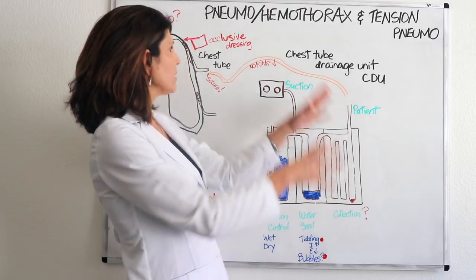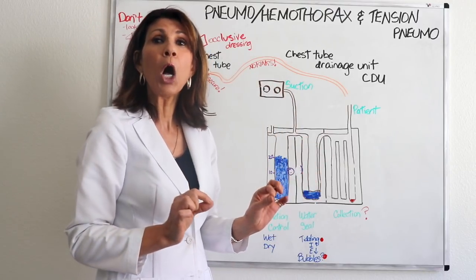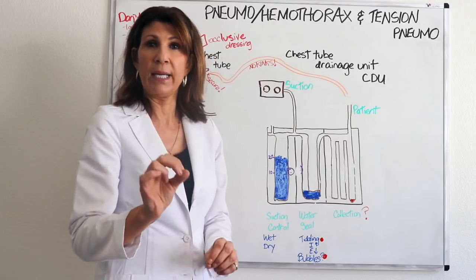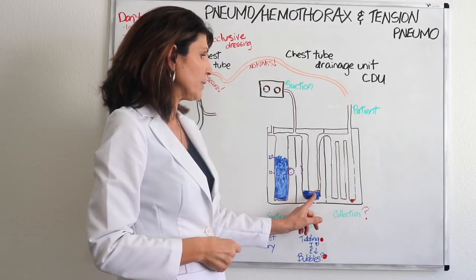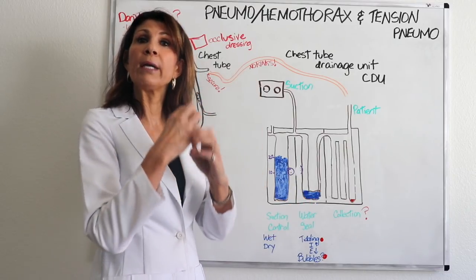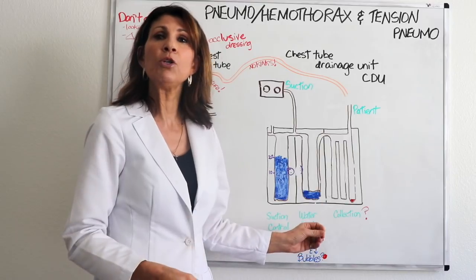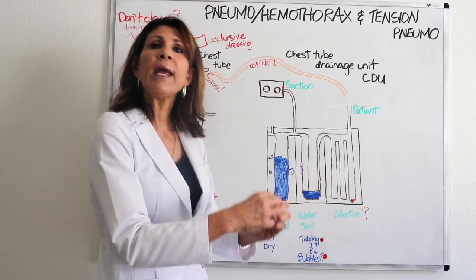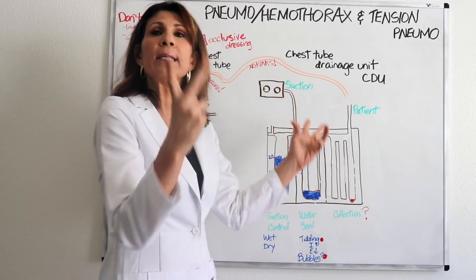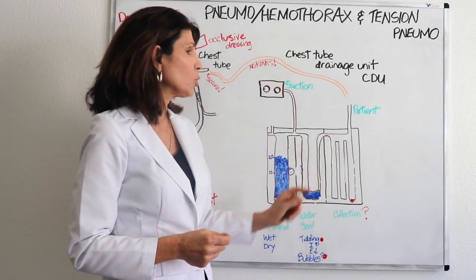So how would you know if this whole system has a leak? This is going to give it away. You're not going to know any other place if there's a small leak that's undetectable except through here, because this is going to manifest that constant bubbling that would show if air is escaping through the system. The other time that you might see bubbles is different from when there is a leak, because in a pneumothorax, when you're resolving it with a chest tube, you would see the air from the pleural space bubble through in that water seal chamber. You'd actually see it come through. So you can tell the difference between a leak and a normal, almost like a burp that comes through in this water seal chamber.